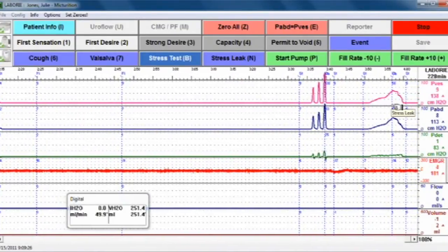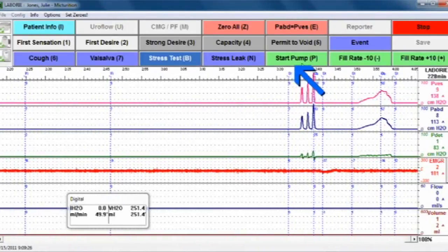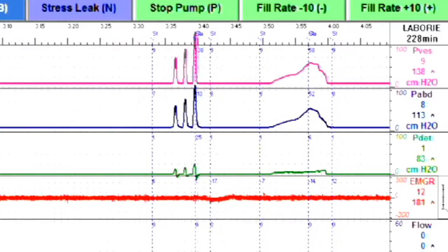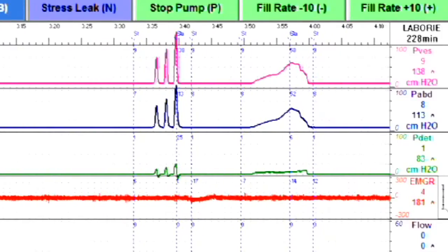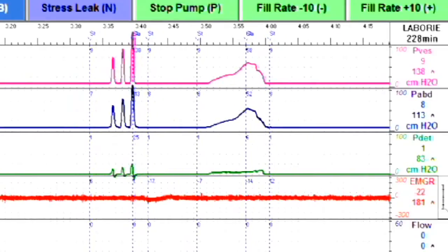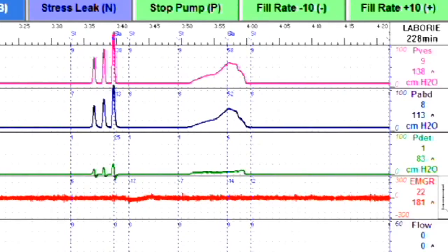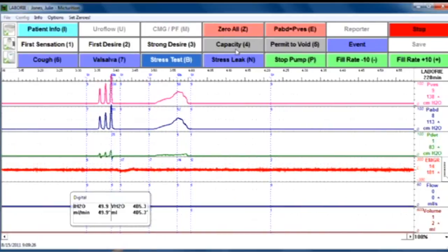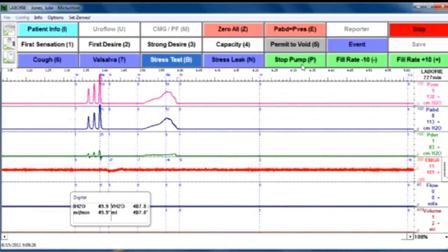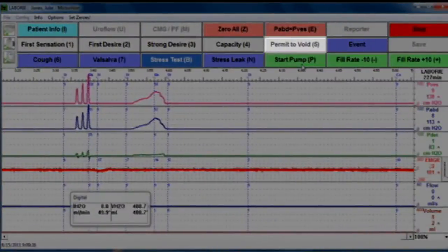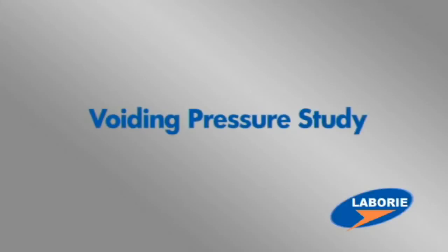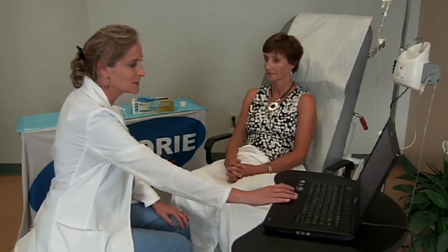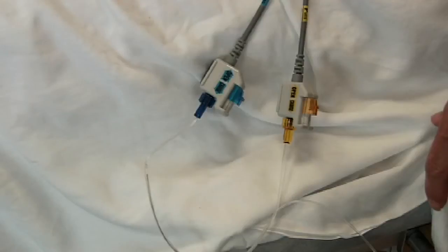After testing for a leak point pressure, you will continue the test by hitting start pump. You may stop the pump every 100 milliliters of fluid or so until you are comfortable that you have captured a good example of the patient having a stress leak, if appropriate. You may want to get the patient to stand up if it's difficult to evoke a leak while they're sitting. Once the patient has reached capacity, you will hit stop pump and then permit to void.